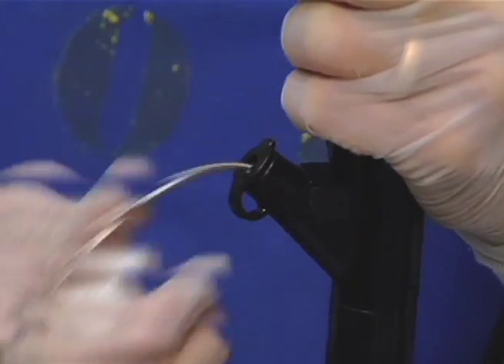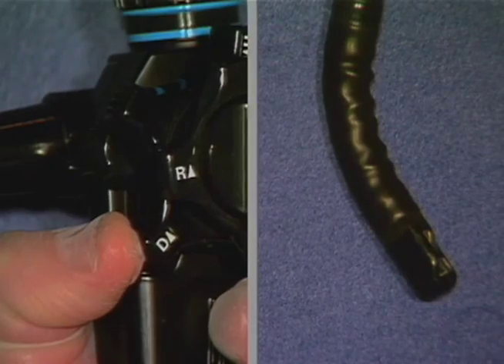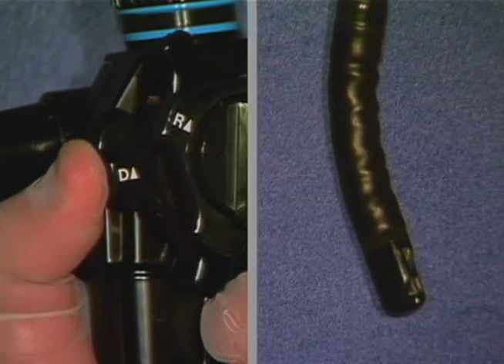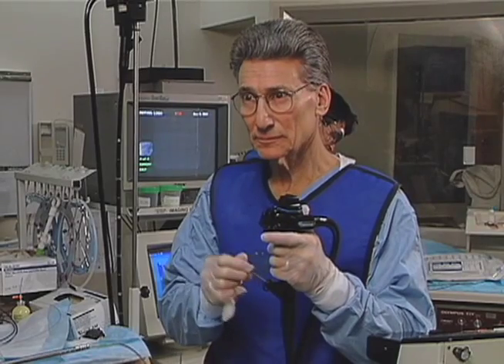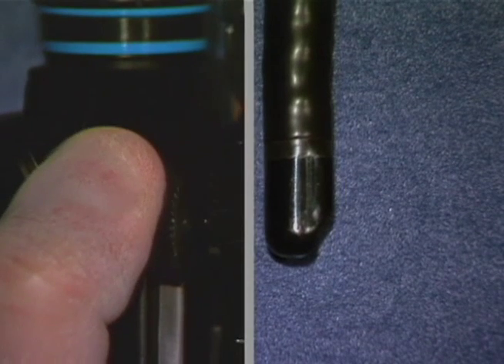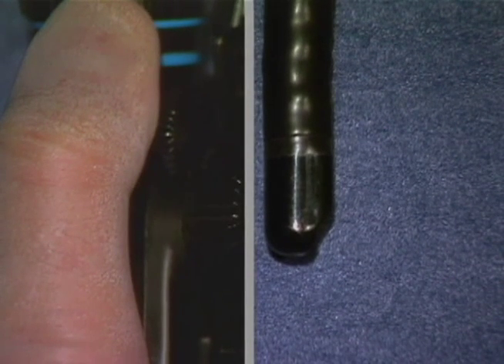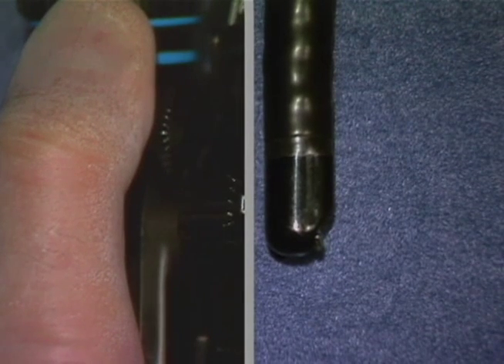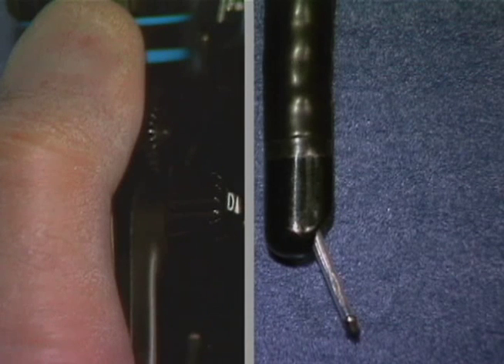If the lithotriptor encounters resistance during insertion, do not force it. Relax the endoscope's angulation mechanism until the lithotriptor sheath can be passed smoothly. Hold the lithotriptor close to the channel when inserting. Lower the forceps elevator when the basket tip touches the forceps elevator.